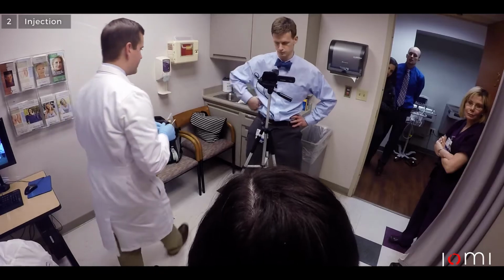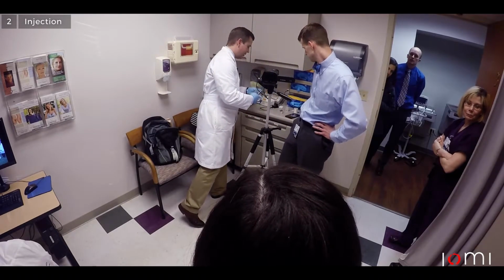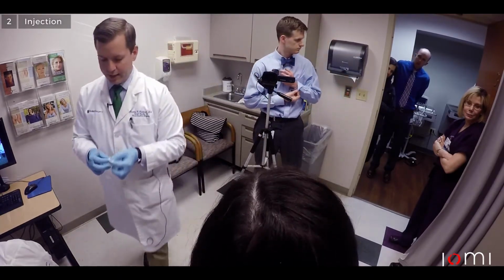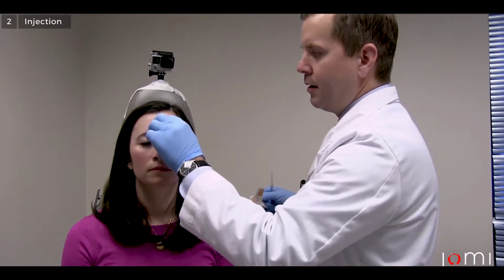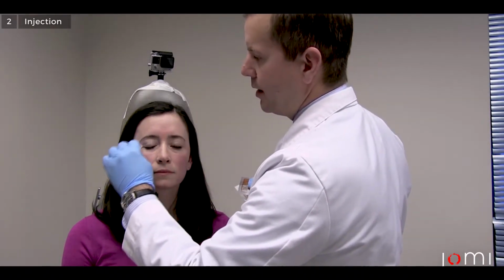So now I'm going to get a couple of alcohol swabs and just clean off the areas that we're looking at injecting. So again, the glabella region, the lateral orbicularis region, and then the forehead region.